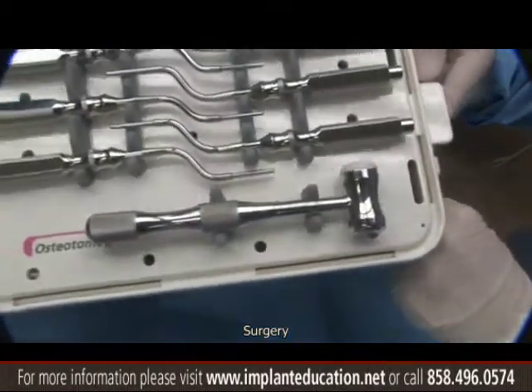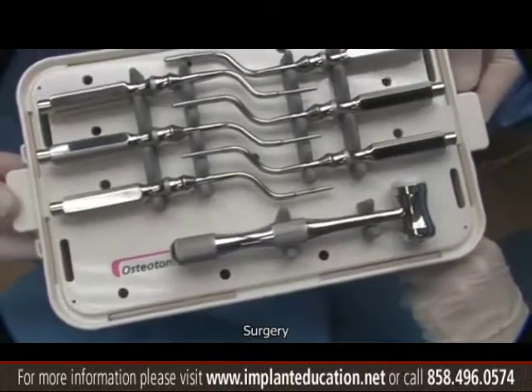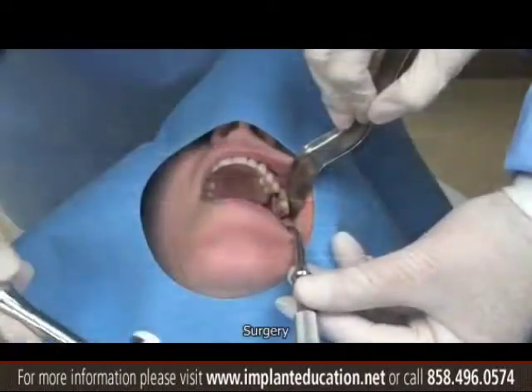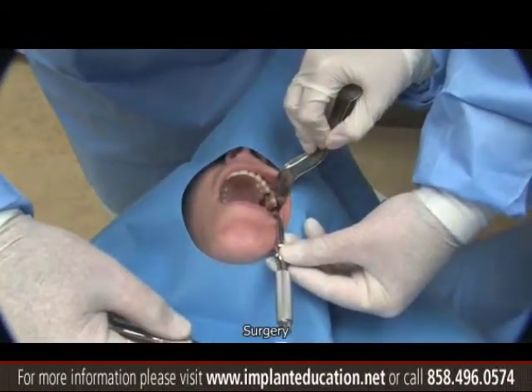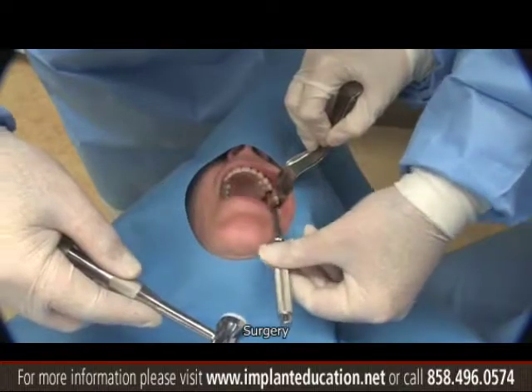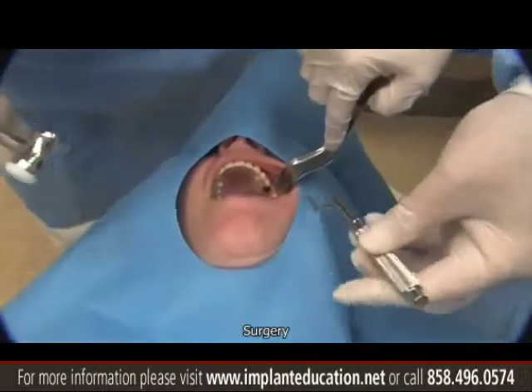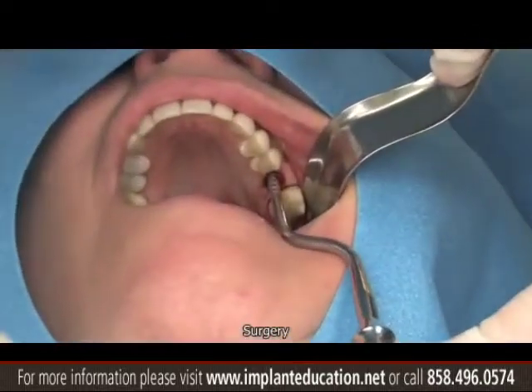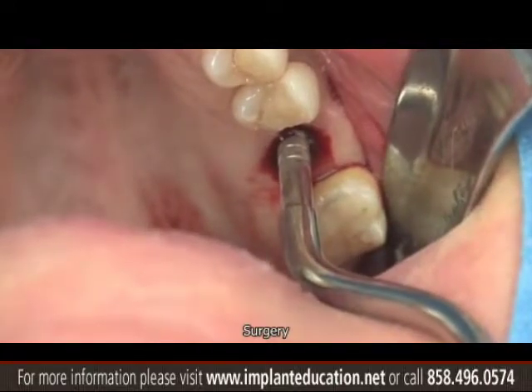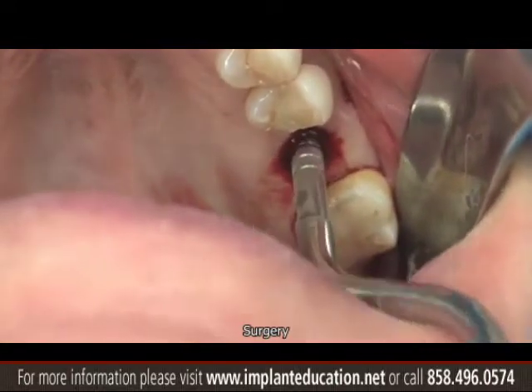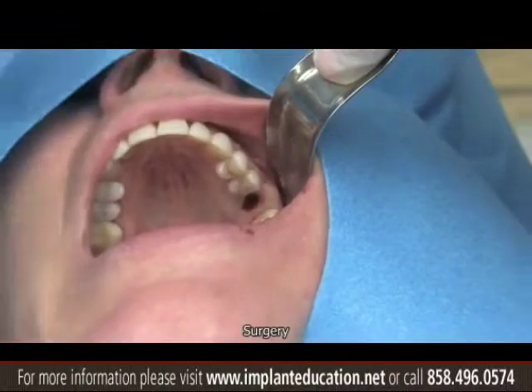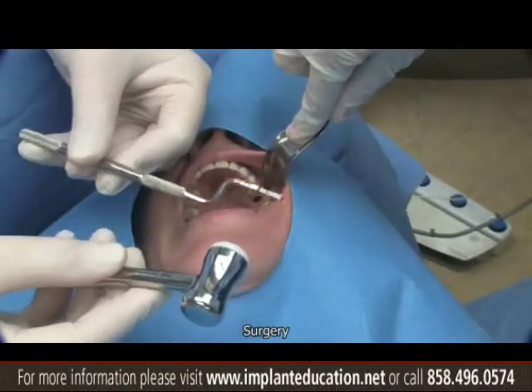We took an X-ray with the 2.0 parallel pin. After the 2.0 drill, we switch to the osteotome kit — you should use the one that belongs to the implant company you are using. We are going to use two osteotomes from a 6-diameter kit: the first to enlarge the osteotomy from 2.0 to 2.8mm, and the second to enlarge it further to 3.9mm.